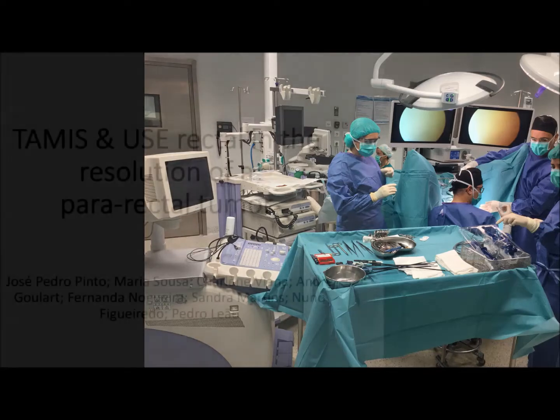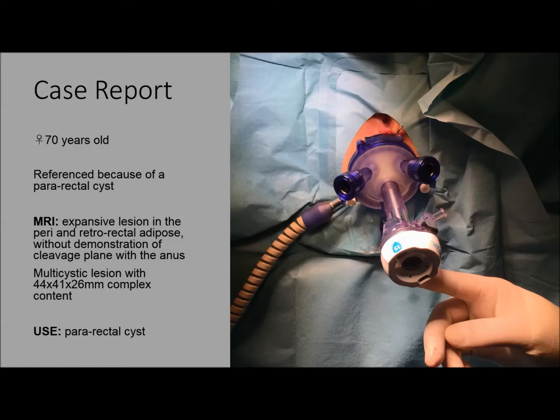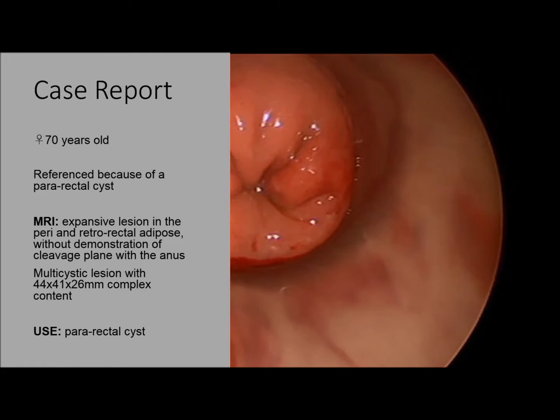This video concerns a para-rectal cyst. A transanal minimally invasive surgery approach with rectal endoscopic ultrasonography was used in a cooperative surgery performed in association with gastroenterology.